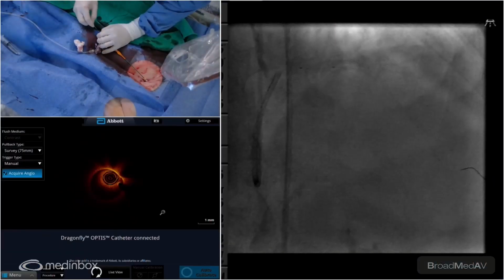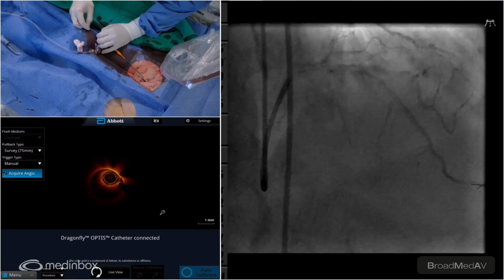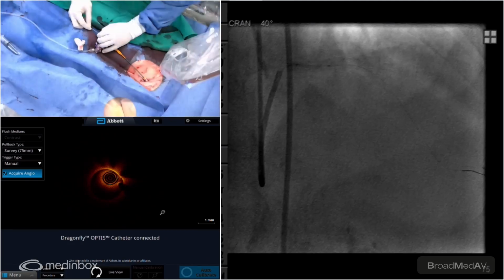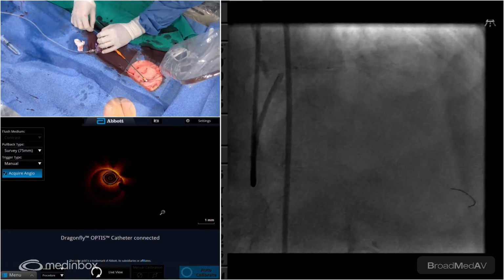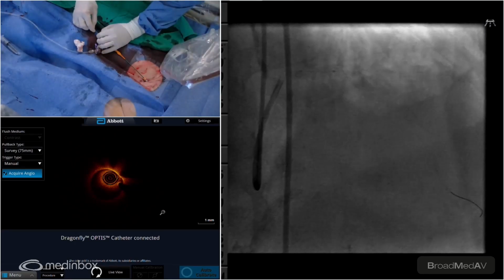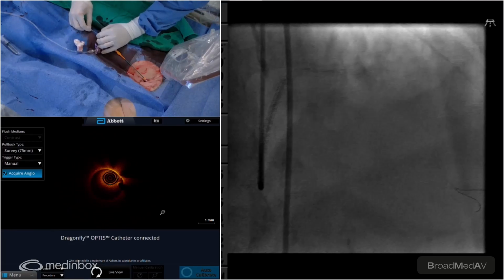Not too bad. Little test there. I want to make sure we're hitting it right on the spot. Perfect. Let's go up there. I think I got it. Let's go to 12. Can we go to 15? Can I get 15? Okay, and down. Let me see how easy this goes. 12 and down. Let's hit it again. Up. I'm going to go up with our 2.0 Sopy balloon here. Get some opening there. I think it's going up not too bad. Okay, let's come down. 12.